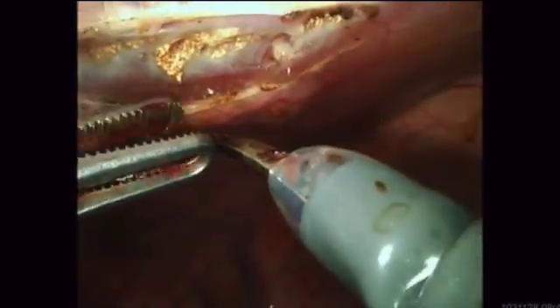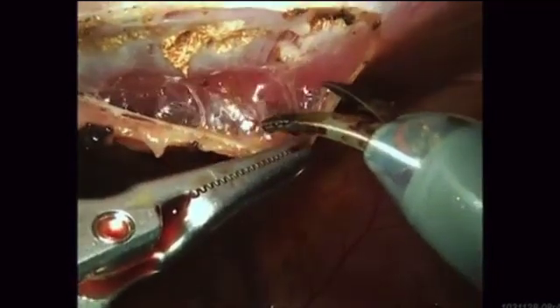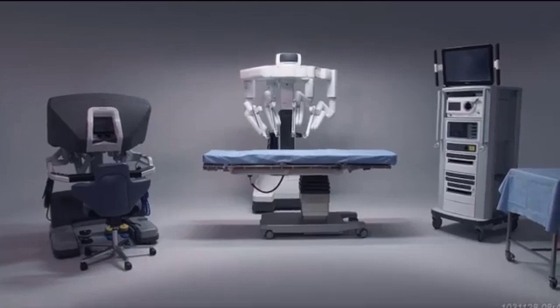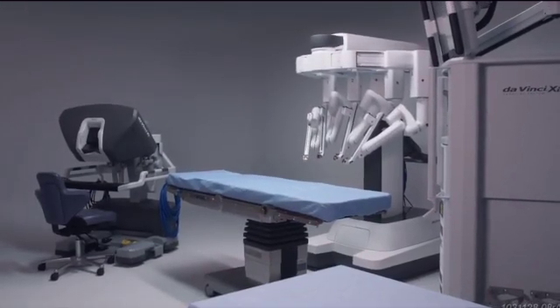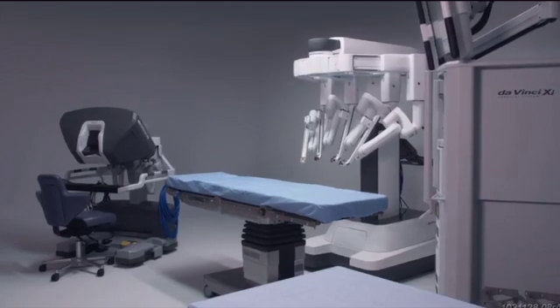Fogging of the da Vinci Xi endoscope tip can affect visibility during procedures. Endoscope fogging occurs when a temperature differential exists between the scope tip and the air in the body cavity. To prevent and manage endoscope fogging, the sterile staff and surgeon should follow these guidelines during setup and procedure.